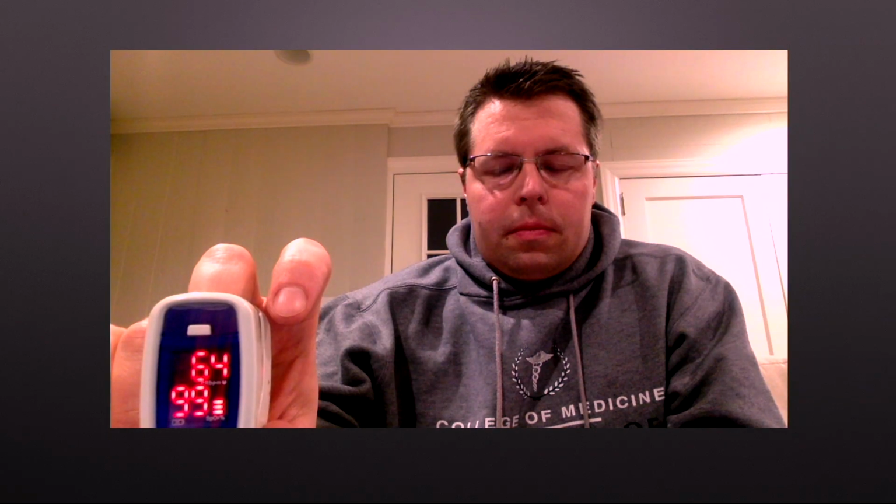You'll notice that he is initially breathing and then takes a breath and holds it. Now we're at sea level, room air. He's a reasonably healthy, possibly slightly out of shape guy, but you see his pulse ox at the bottom and his heart rate. Heart rate in the 60s, pulse ox 99% at baseline. He's been holding his breath so far, and definitely apneic, 100%, but you notice that the pulse ox itself has not changed, has not flinched, has had plenty of time to do so if it was actually detecting apnea.